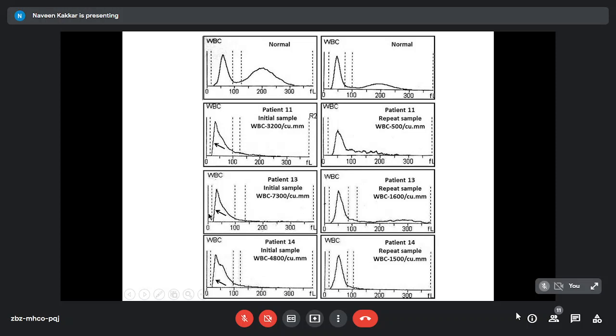So this pattern we didn't pick up till the fifth or sixth case. Then we started noticing this pattern and put this collection together for a publication also. And on repeat samples, your ascending and descending limb are now matching with the normal ones. So these are clues in the histogram that tell you that this patient needs a smear or a careful screen of the smear.